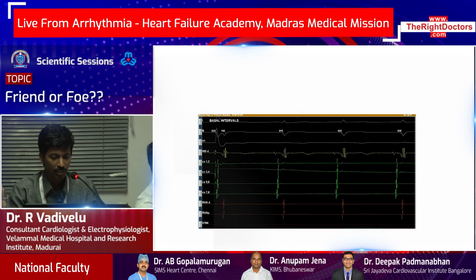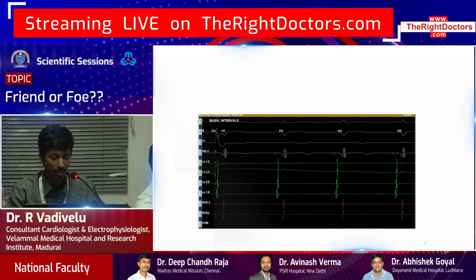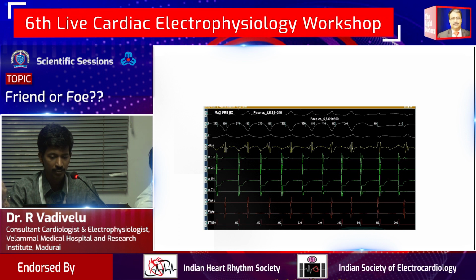Okay, this is on atrial pacing. There is pre-excitation. This pre-excitation is becoming maximal, and the HV is also getting shorter. This is the tachy induction, and we can say the earliest activation is somewhere in the CS 5-6 region, with evidence of bracketing.